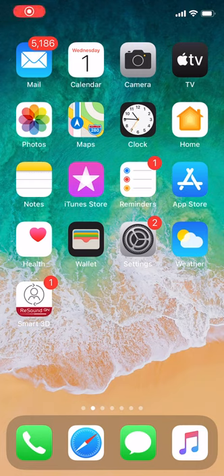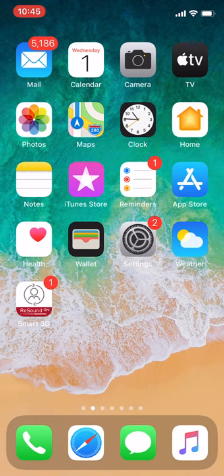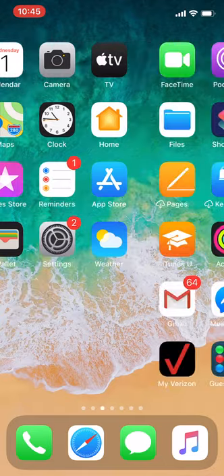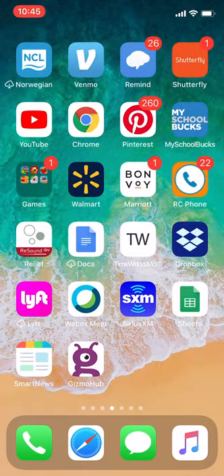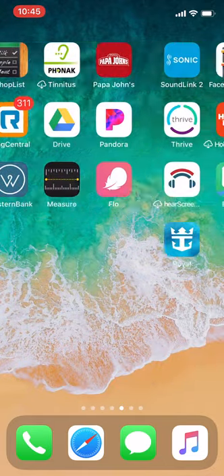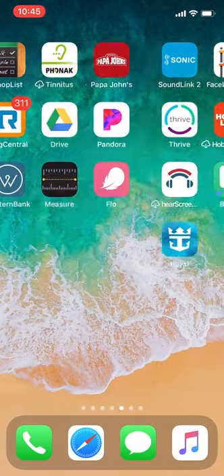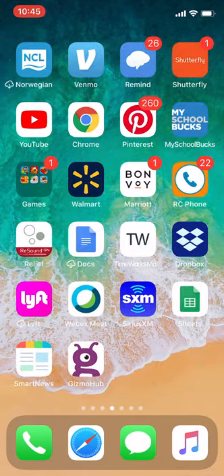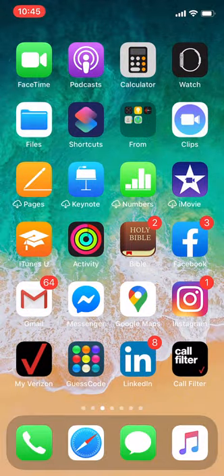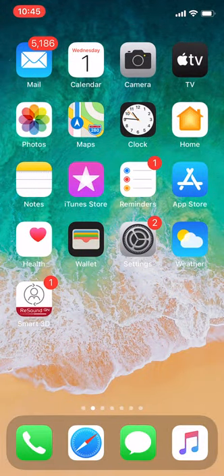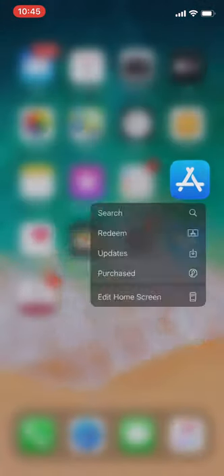Once you have paired your hearing aids to your iPhone, you can now use the app that is designed for your hearing aids. So for the Sonic hearing aids, the app is called SoundLink 2. You will need to go to your App Store. Your App Store is this icon right here.